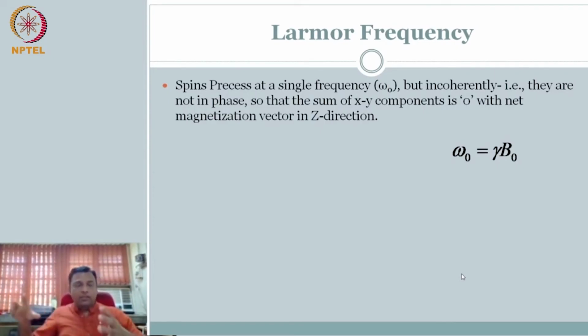Given that you all are supposed to behave the same, you are all hydrogen, no matter what happens, after some time is given after the external magnetic field is applied, eventually everybody would have come doing this.